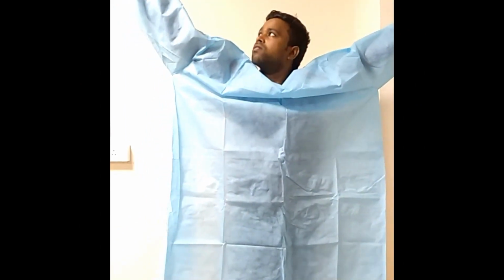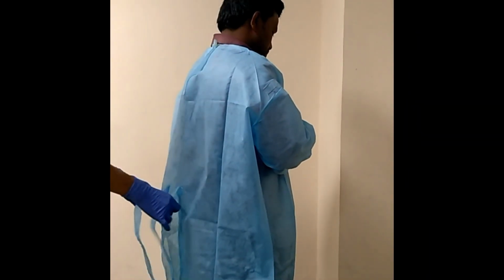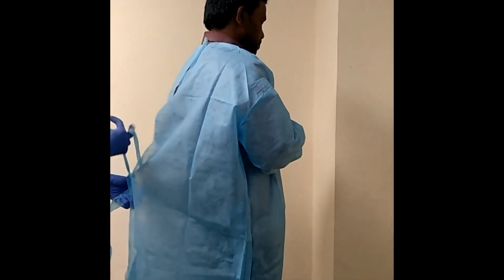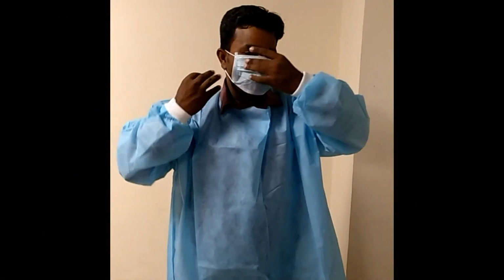It is important to always wear appropriate PPE while collecting clinical specimens. The recommended order of donning, that is, wearing of PPE, is hand hygiene, followed by gown or lab coat, then surgical mask or respirator, followed by goggles or face shield, and finally wear the gloves.